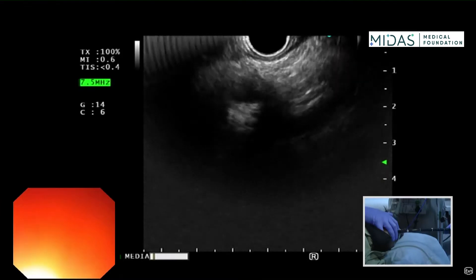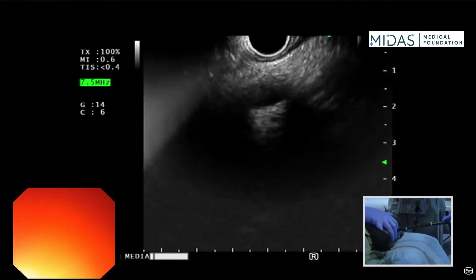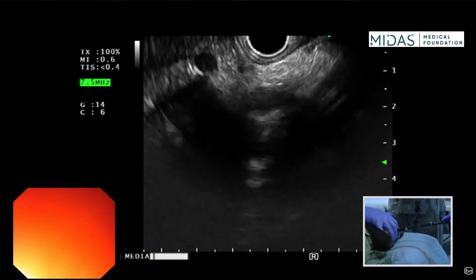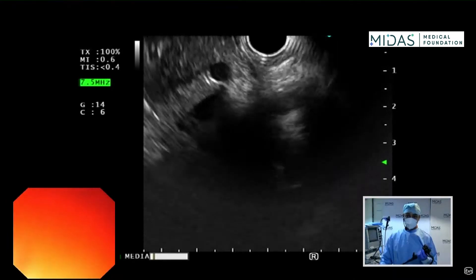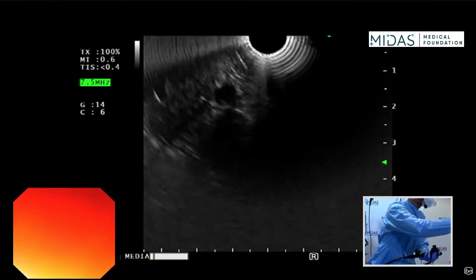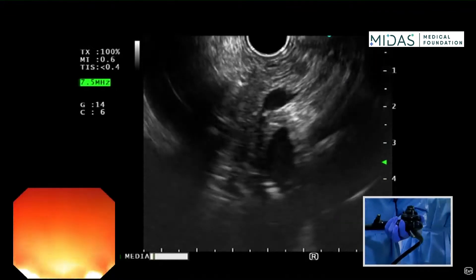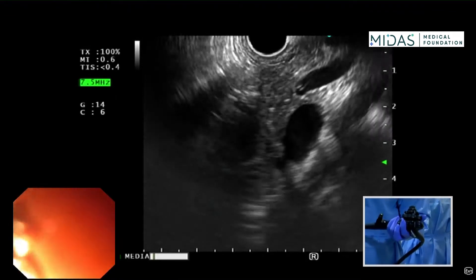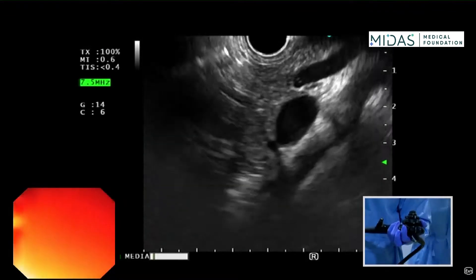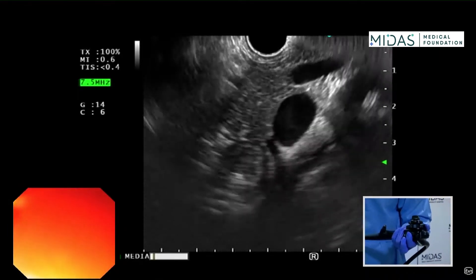Now that's an important structure to identify. Once you see the celiac artery takeoff, the next thing to do is to use your big wheel away from you. And what you see on the screen is the pancreas — this is the salt and pepper appearance of the pancreas right there.